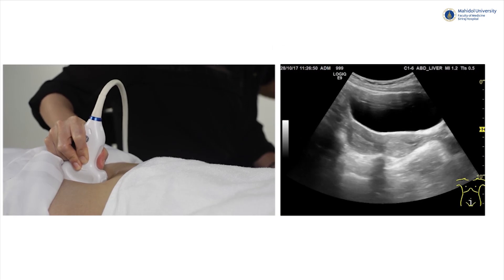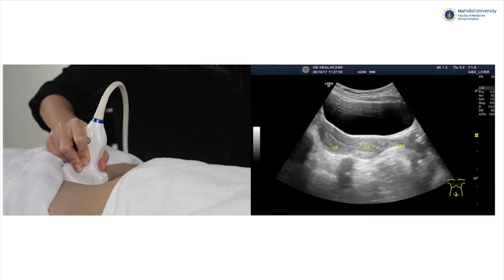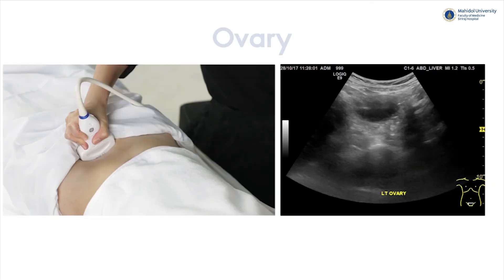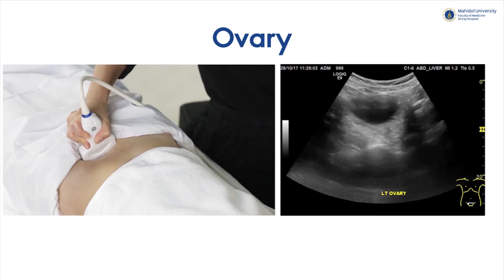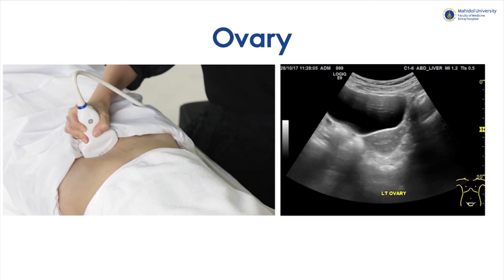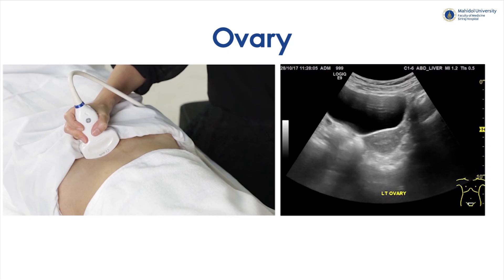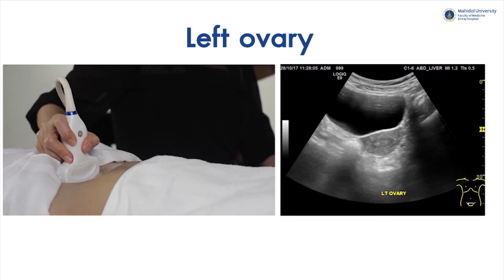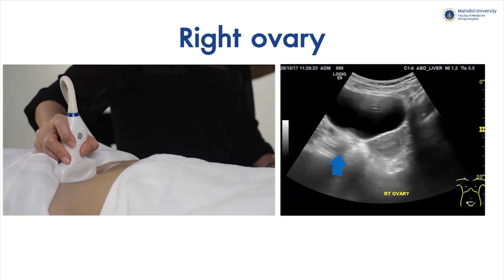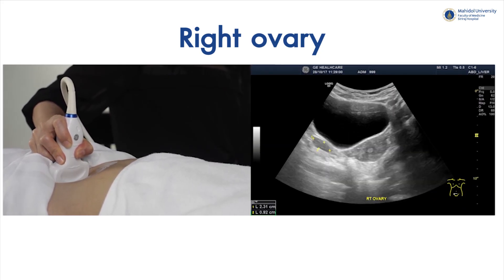Inferior to the uterus in longitudinal plane are the cervix and vagina respectively. For the ovaries, we could see them in some patients but not in everyone. To examine the ovaries, we should press at the respective contralateral sides in order to use the bladder as an acoustic window. For the left ovary, press on the right side of the bladder, and vice versa for the right ovary. Normally, ovary size should not be more than 2.5 x 3 cm.